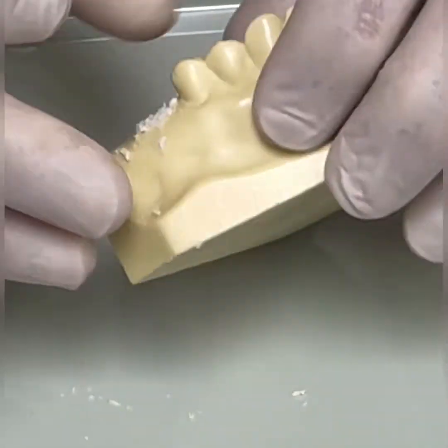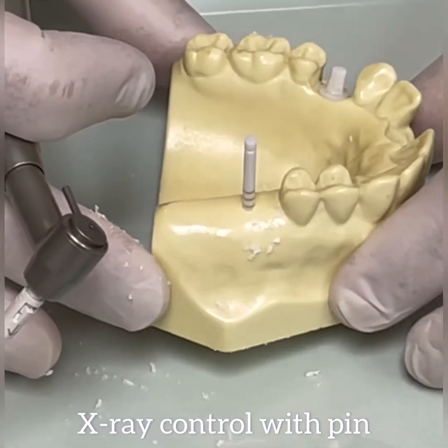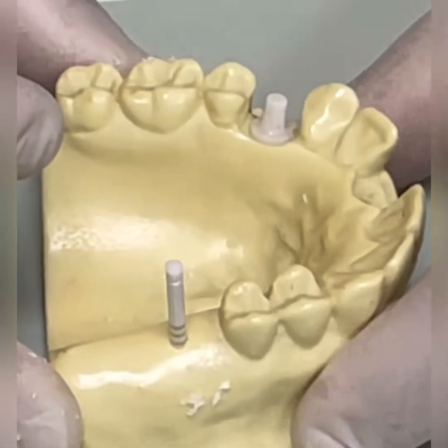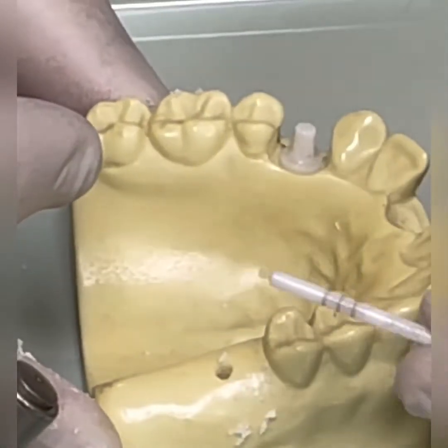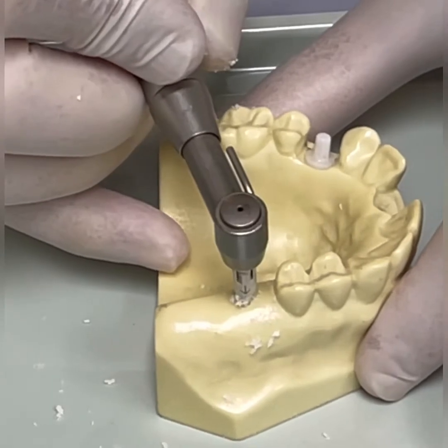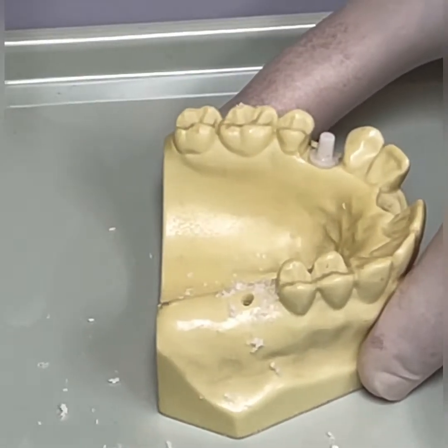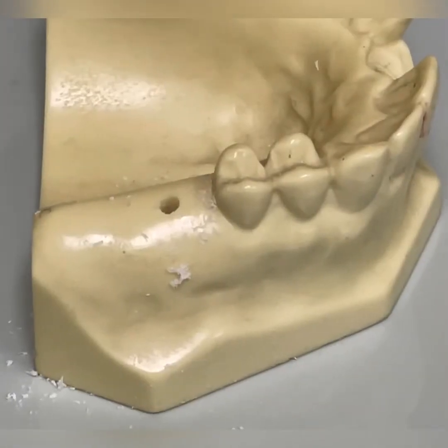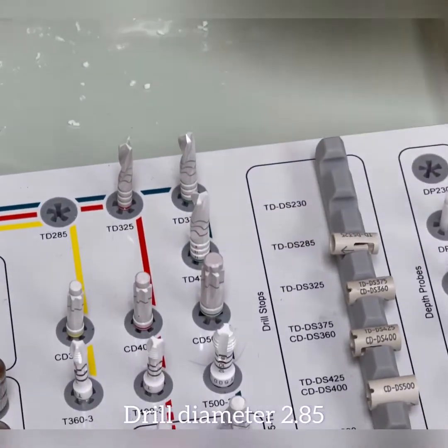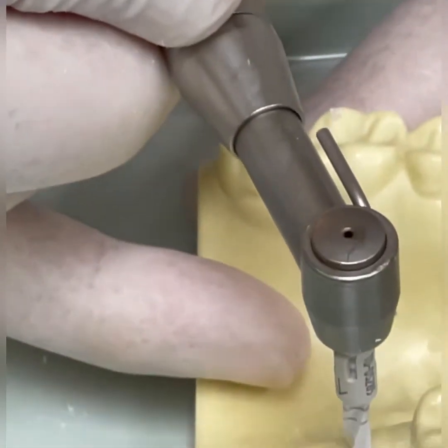We take an x-ray with the marker. Based on how the x-ray comes out, we make our corrections. The marker is at eight millimeters. Let's assume everything is correct and we're going to go straight down to the 12 mm depth. That was the pilot drill. Now the next drill is the one up — again we have to use its corresponding stop. We continue at 600 rpm.